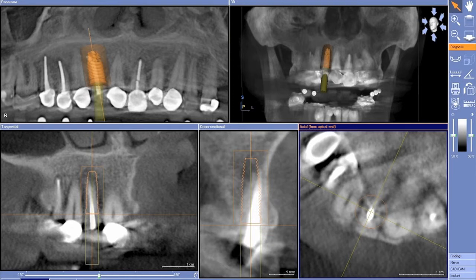We can see, as we normally expect, anterior teeth — the roots are tipped out to the buccal. So if we follow the socket, we will generally end up outside of the bone. So when replacing implants immediately into the anterior area, we have to lean and plan on our implant being placed to the palatal of the existing socket.